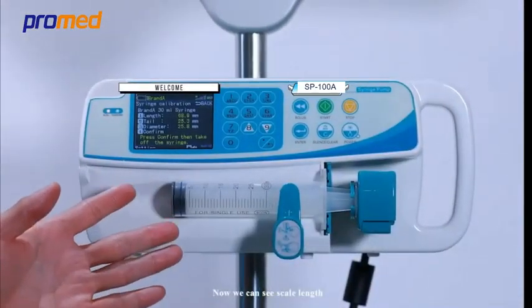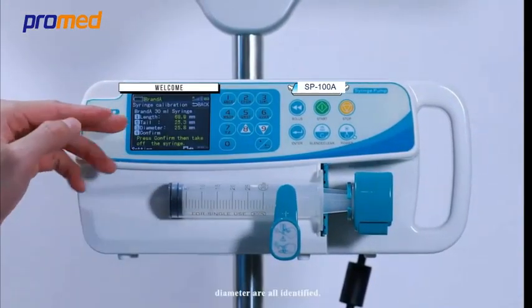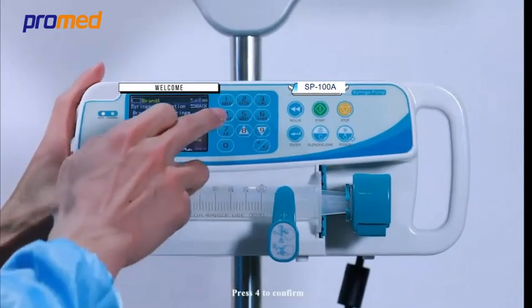Now we can see that scale length, tail length, and diameter are all identified. Press 4 to confirm.